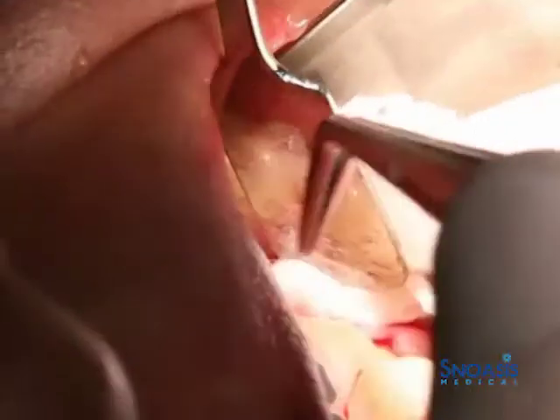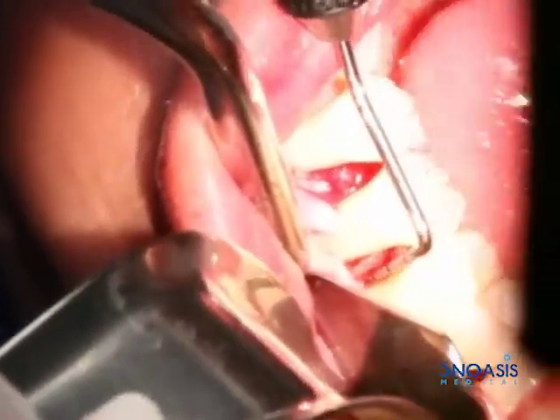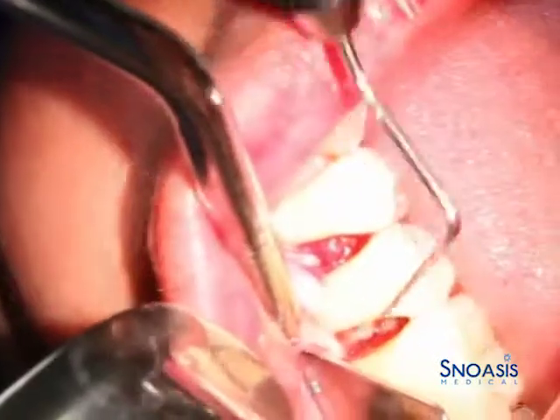We're going to pack a little gauze in there and then we'll be able to see the defects a little bit better. We've got about a 5mm defect on the distal and just a little bit of tissue right there, close to the same on the mesial.